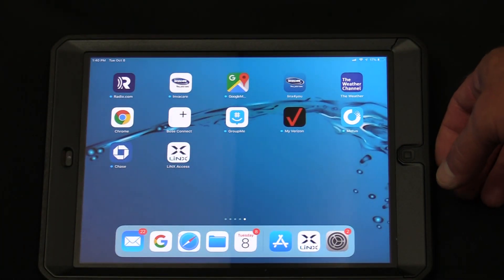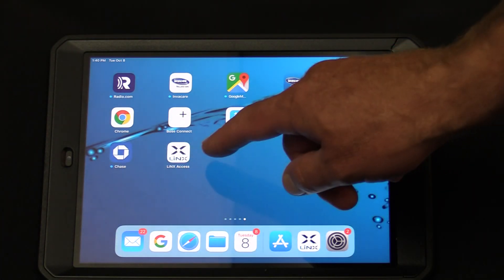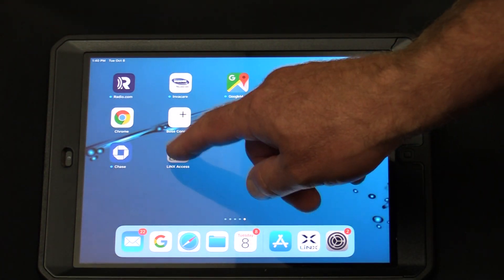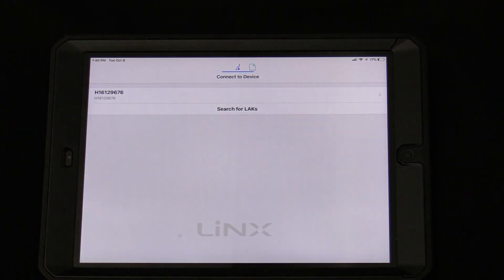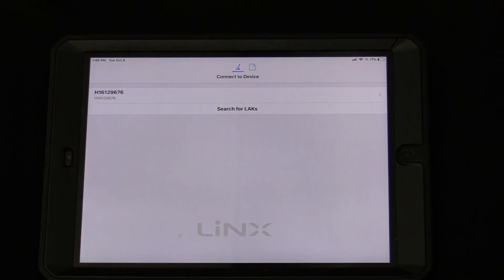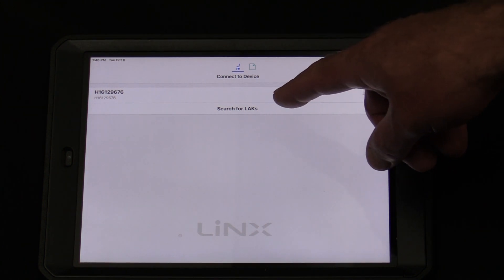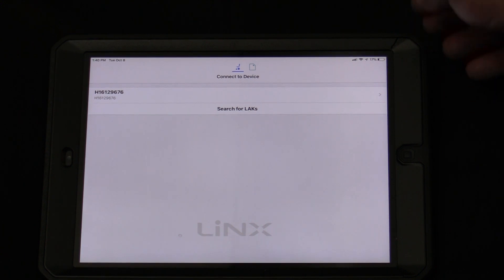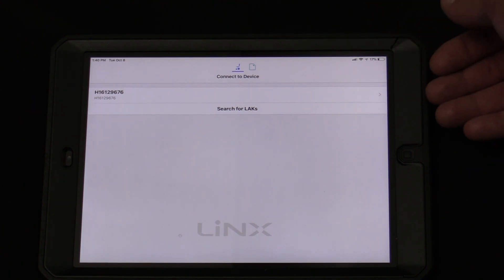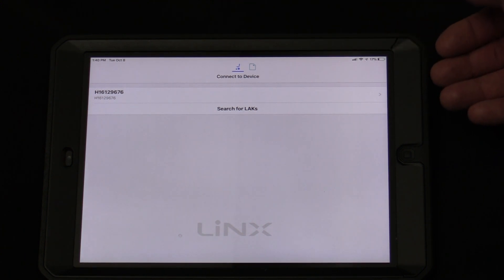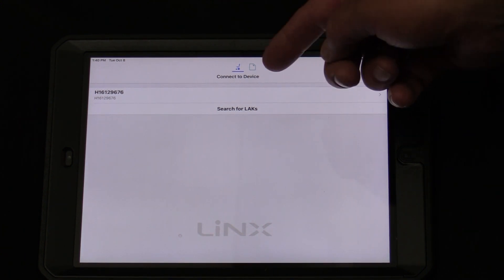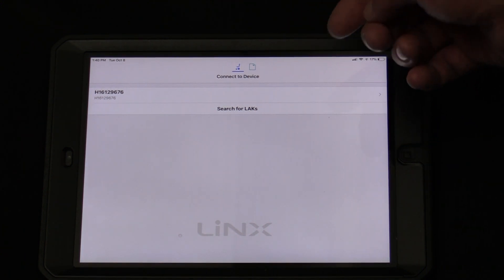Next, we are going to open up the Lynx Access app. In most cases, when you are connecting for the first time, you are going to want to hit Search for LACs. In this situation, my app has already connected to the chair, so it is discoverable.